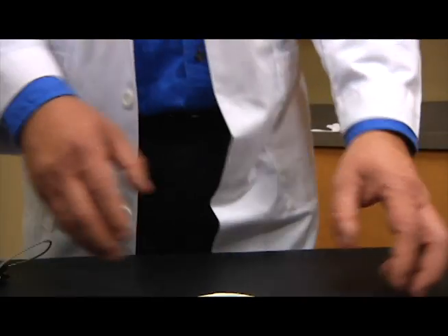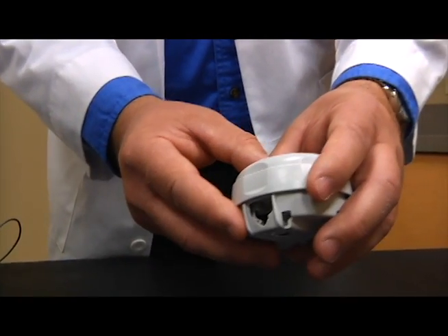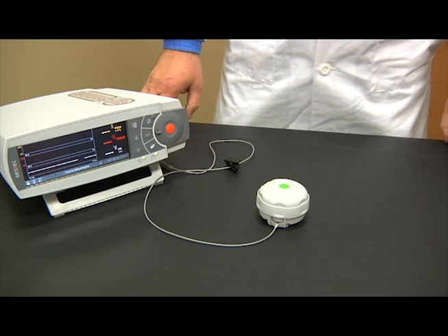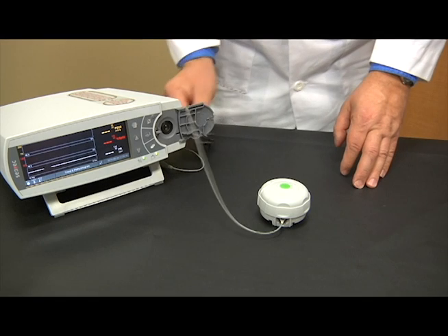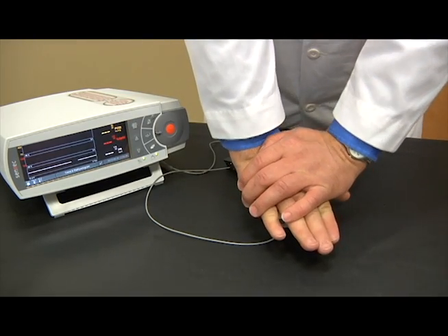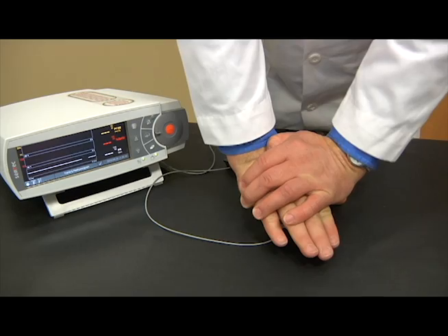Do not pick up the membrane changer, as this may lead to dislodging the sensor from the membrane changer, resulting in an unsuccessful membrane change. Begin the four-step process by pushing down firmly on the membrane changer and holding for three seconds. You will hear a click, which indicates the old membrane has been removed.